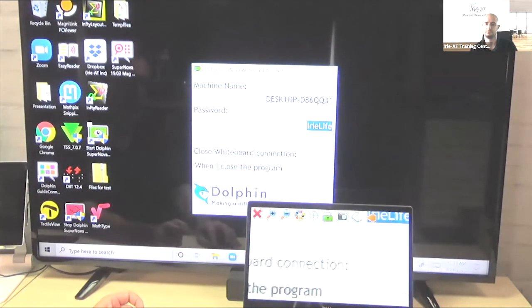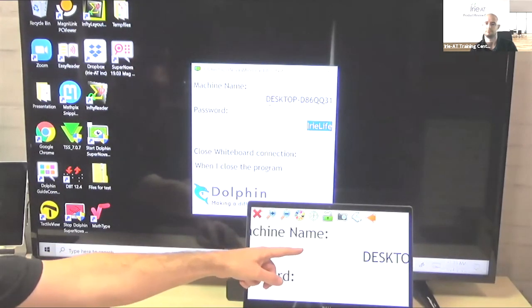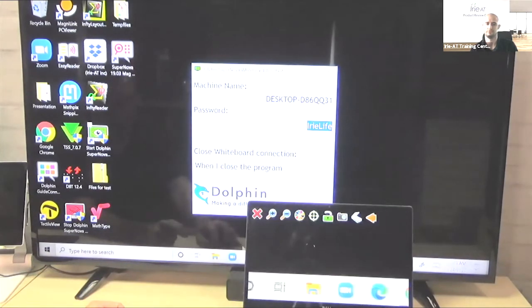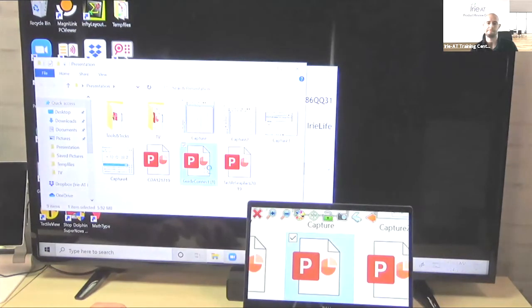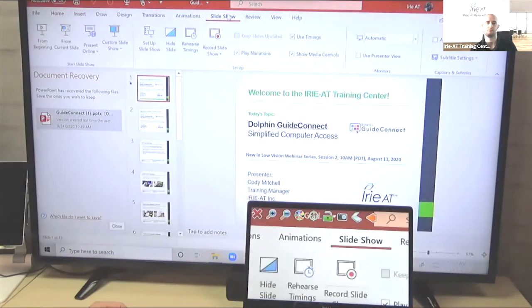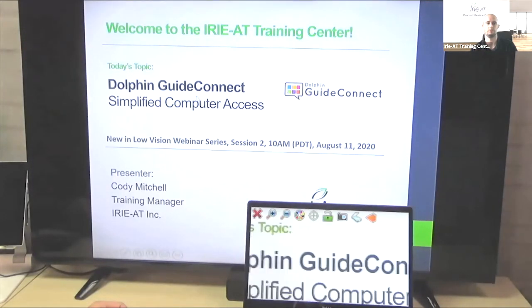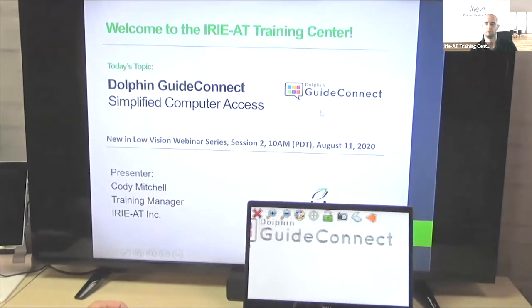And now if the teacher wants to show me something in particular, it's going to move along with the mouse wherever I'm going. So I'll open up my, I thought I had a presentation open. It's all right. Go ahead and fire it up. Get a presentation open. So here's my slideshow. There you go. So wherever I am in the slideshow, it's going to follow along. The student's going to see what's going on.